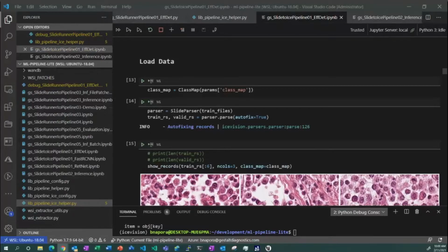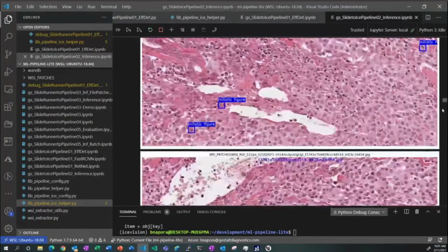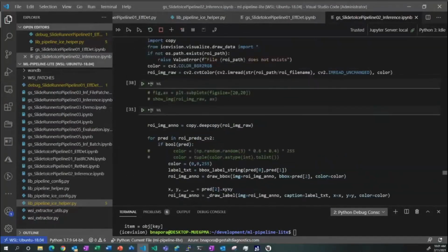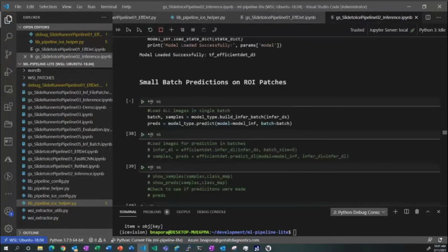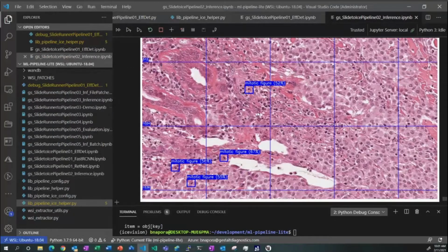Any questions? And Fareed and Lucas, if you guys can, any questions about the details of the architecture, hopefully you guys can contribute as well. Yeah, just at the very end there on the inference image, you have some percentage showing on each class. Is that the confidence level or something else? Yeah, just the confidence level. All right, yeah. Where is my, oh, here we go. Yeah, that's the confidence level coming out of the inference.